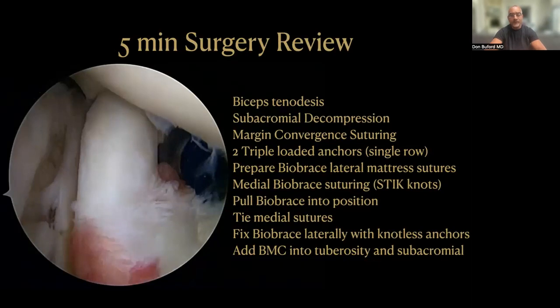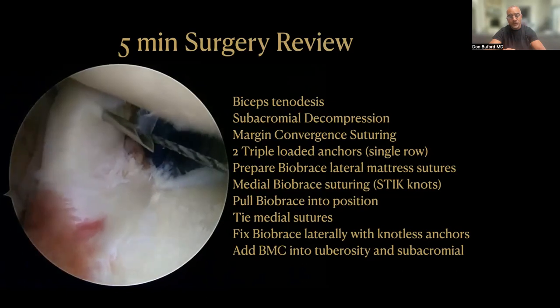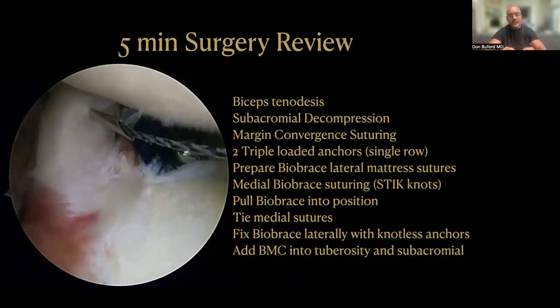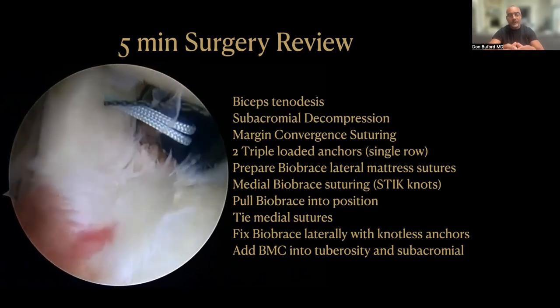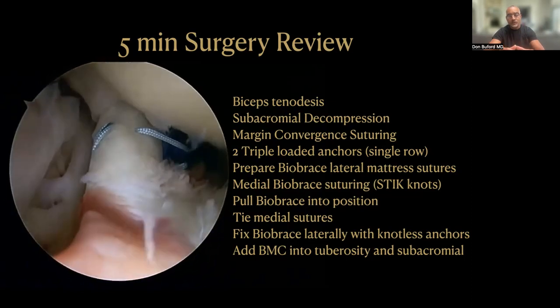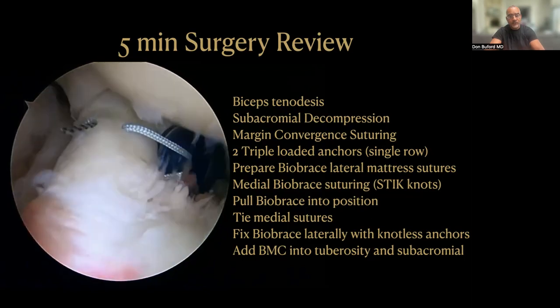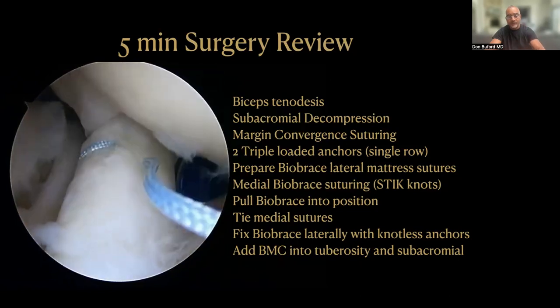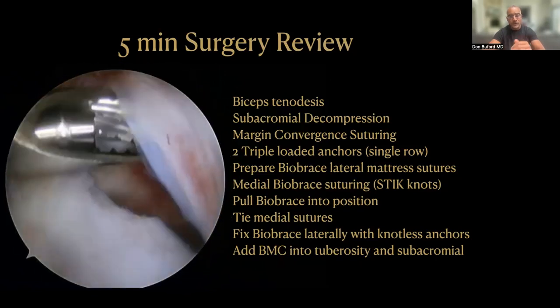Now let's go through an abbreviated surgical video. In this lateral decubitus position, the first step is to evaluate the biceps tendon and decide if we're going to do a biceps tenodesis or leave it alone. We've decided to do a superpectoral biceps tenodesis — taking a spinal needle and passing it right through the tendon, using a shuttle relay to bring suture back through the biceps. Doing this a second time and retrieving the suture from the posterior aspect gives us a purse-string-style mattress suture around the biceps tendon, which we later fix using a knotless suture anchor. We then use scissors to do the tenotomy at its insertion into the superior labrum.